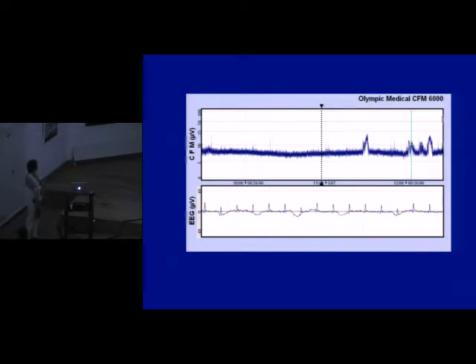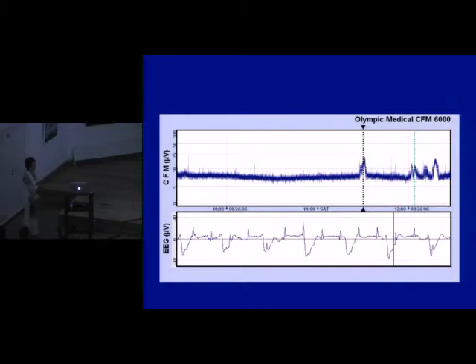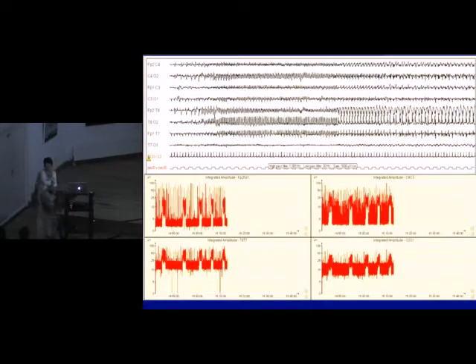So why this EEG? That's because we have this one channel, and we have this ECG artifact on the EEG. So it's almost a flat trace, and the only thing we have on the EEG is the ECG. And right here, we have a seizure. And here you see that. So it's important to recognize this artifact. Otherwise you would interpret this aEEG as normal, which it obviously isn't. It's a flat EEG, so a very severe condition.